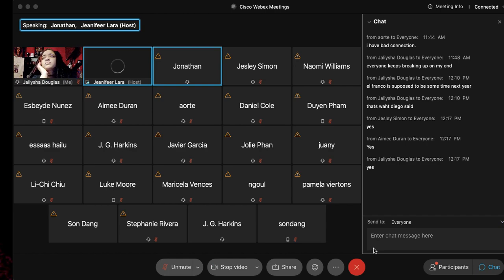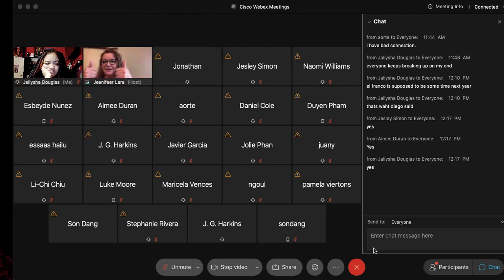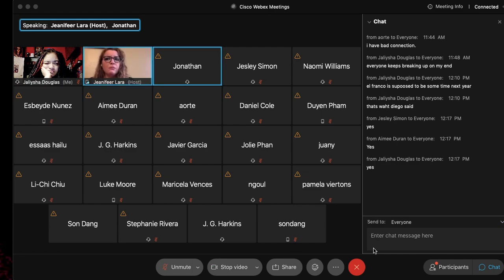One more thing. Do we need to go over film? In chapter 8, there are a couple of sections about film, like the intensity. Right, it was just a small paragraph. What the film world used, and what is important here, is intensifying screens. You're going to see the words intensifying screens again. Intensifying screens were associated with light formation. Keep in mind, we still use that type of technology in CR and in fluoroscopy, but not as much as we did in the film world, okay?